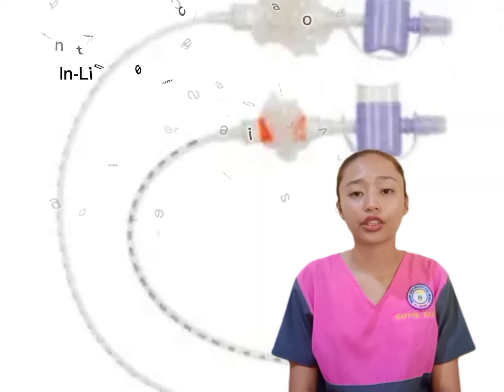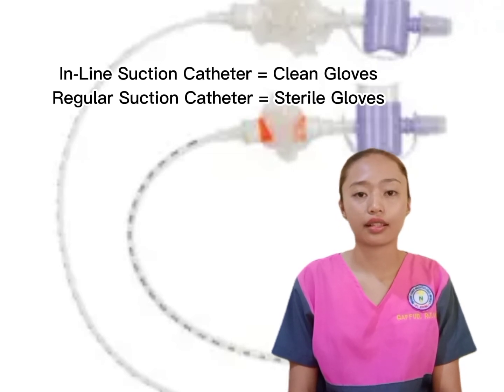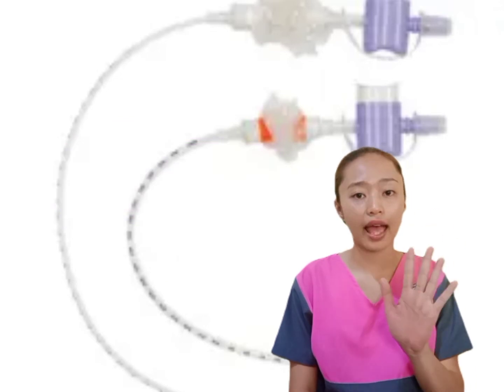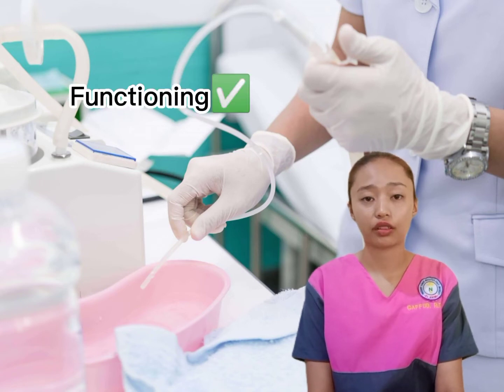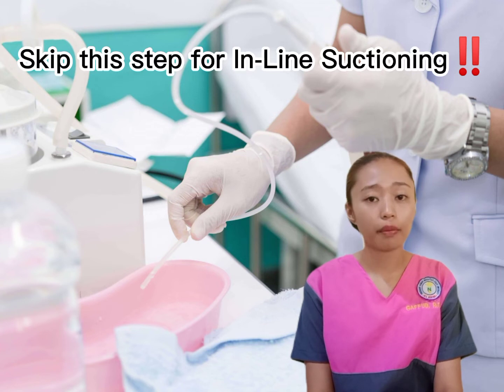With inline suction catheter, use clean gloves. With regular suctioning, use sterile gloves. Maintain sterility. In regular suctioning, the dominant hand must remain sterile throughout the procedure. Ensure equipment function. Check the equipment for proper functioning by suctioning a small amount of sterile saline from the container.